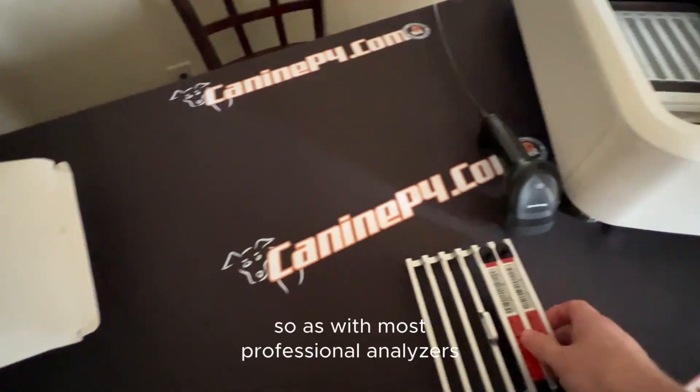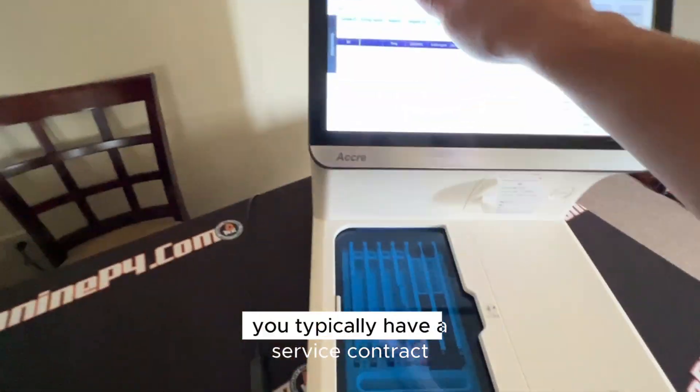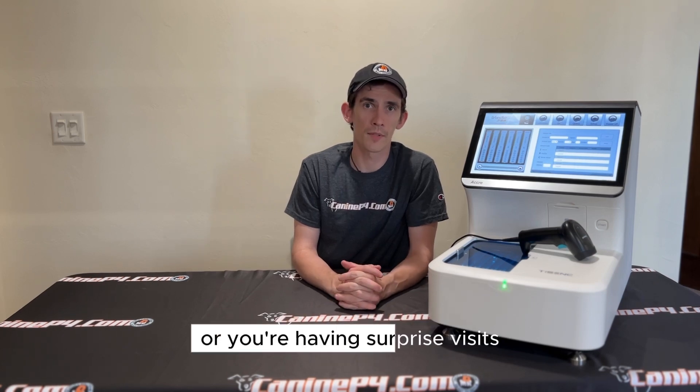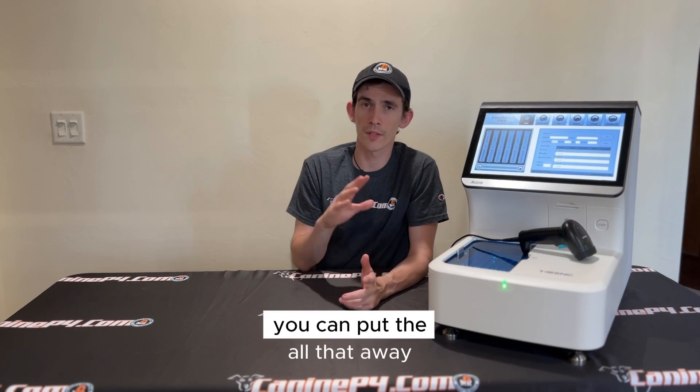So how else does it save you money? No service contracts. With most professional analyzers, you typically have a service contract which can cost you anywhere from $5,000 to $15,000 a year, or you're having surprise visits when the machine does go down. With the Acuri8, you can put all that away.